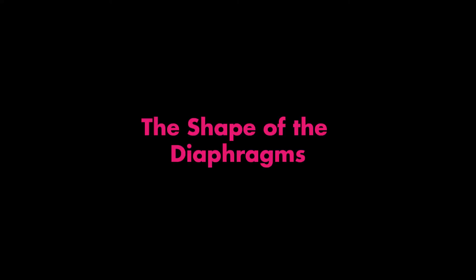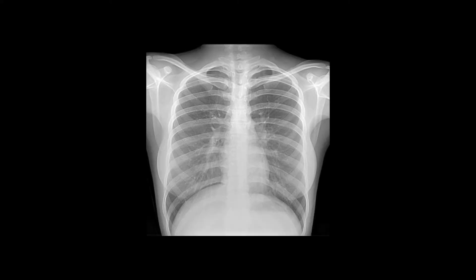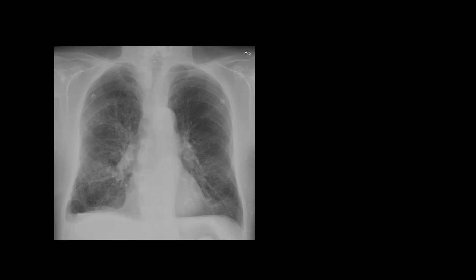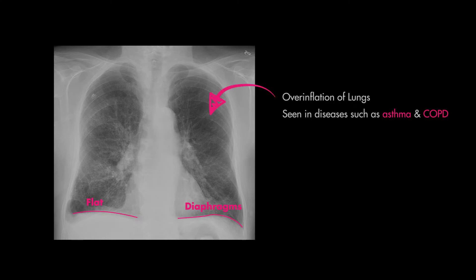When assessing the shape, each hemidiaphragm usually has a curved shape like you see here. However, they may be flat, as in the case of patients with COPD or patients with very severe asthma, which are both obstructive lung diseases leading to overinflation.